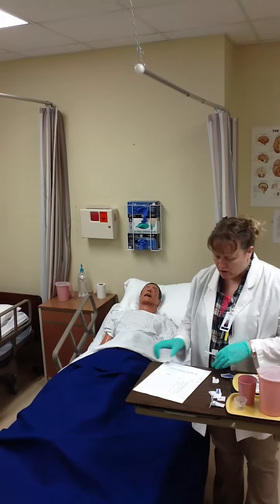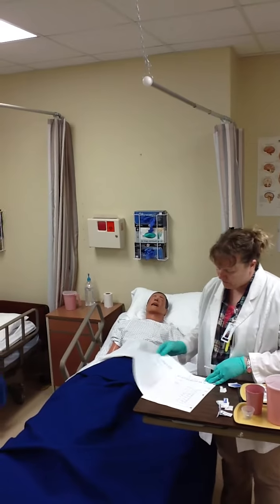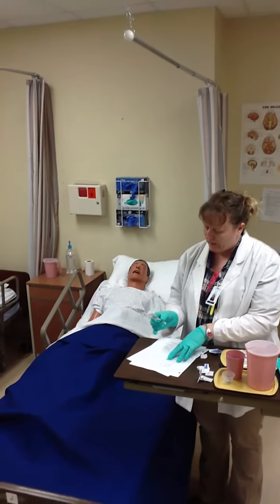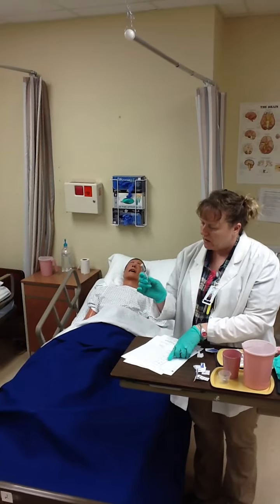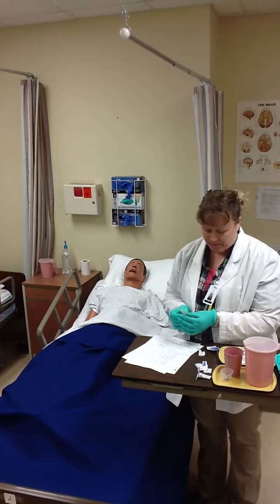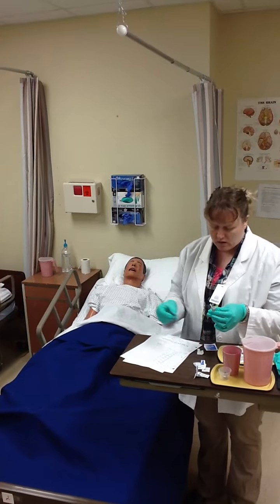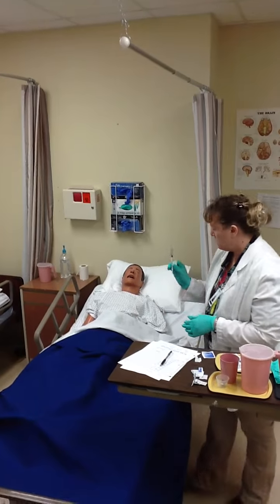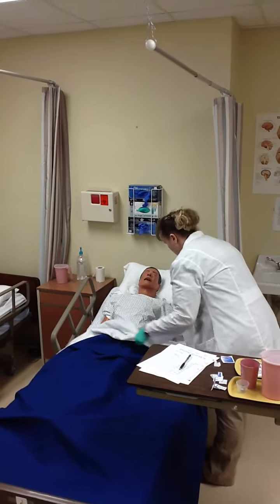So I'm going to check this before I give it. PPD. I have a PPD at 0.1 mL. It's intradermal. I know that I have it. It is due today. And it expires on 11/6 of 12. That is my third check. I'm just going to borrow your forearm.